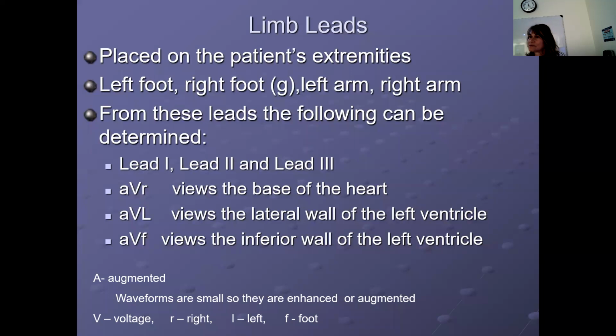Oh, really? I'm just trying to get an idea whether I'm looking at an ST elevation. We'll do another one later on when they're lying down, but we just want to see right away if they have some ST elevation with these leads. And if so, then we can start moving faster.